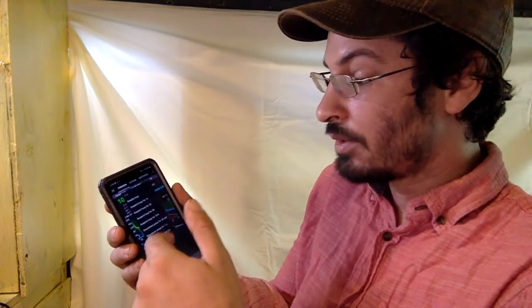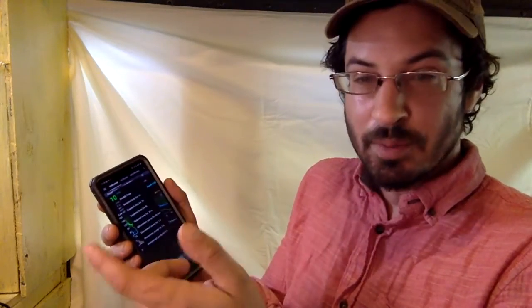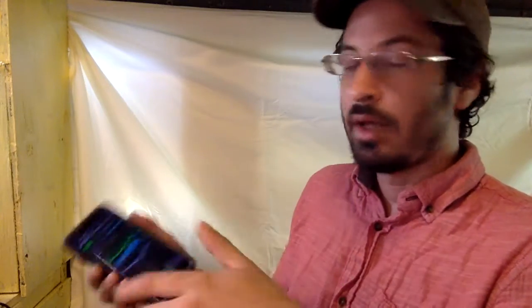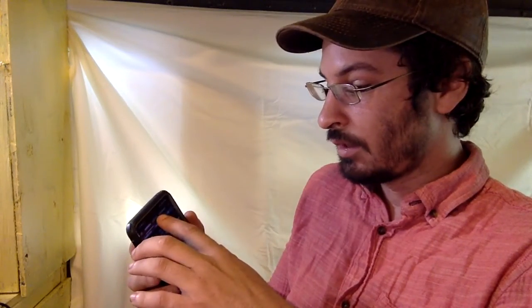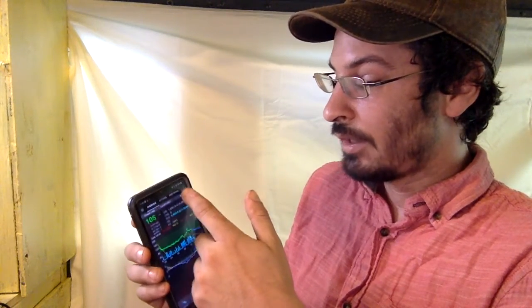I can suspend the loop or disconnect my pump. This is mostly used when you go take a shower or go swimming. I want to disconnect my pump for an hour, and at 1 hour it'll automatically start dosing you again. Local profile, there's the profile I'll get into.